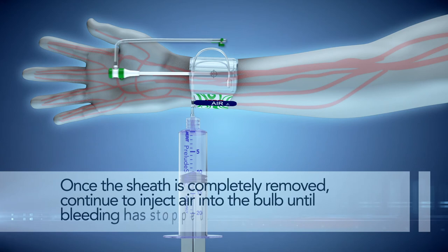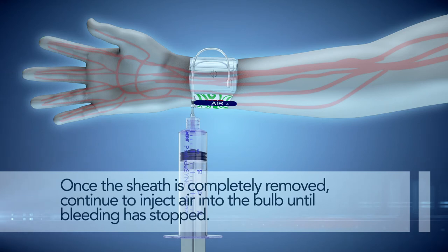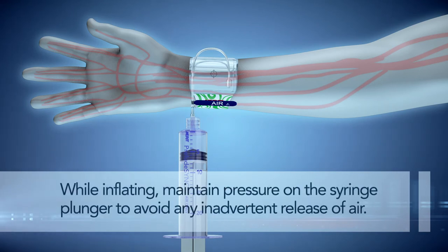Once the sheath is completely removed, continue to inject air into the bulb until bleeding has stopped. While inflating, maintain pressure on the syringe plunger to avoid any inadvertent release of air.